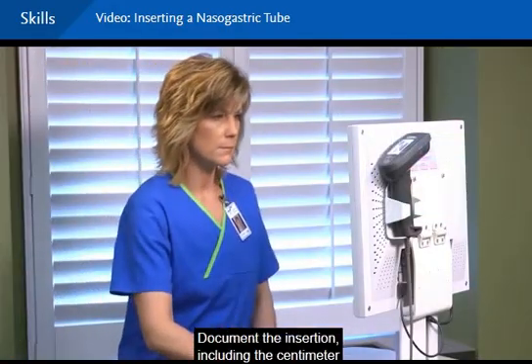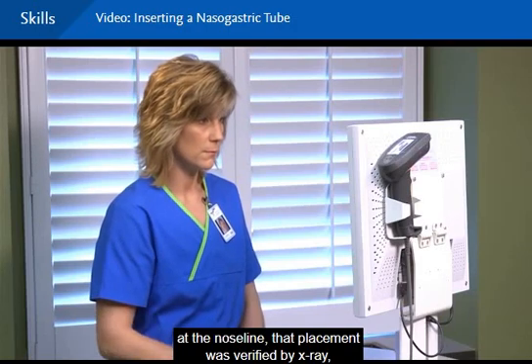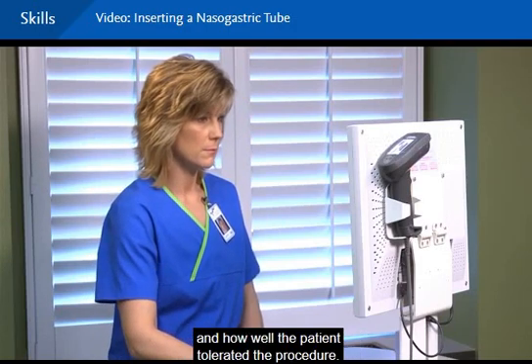Document the insertion, including the centimeter at the nose line, that placement was verified by X-ray, and how well the patient tolerated the procedure.